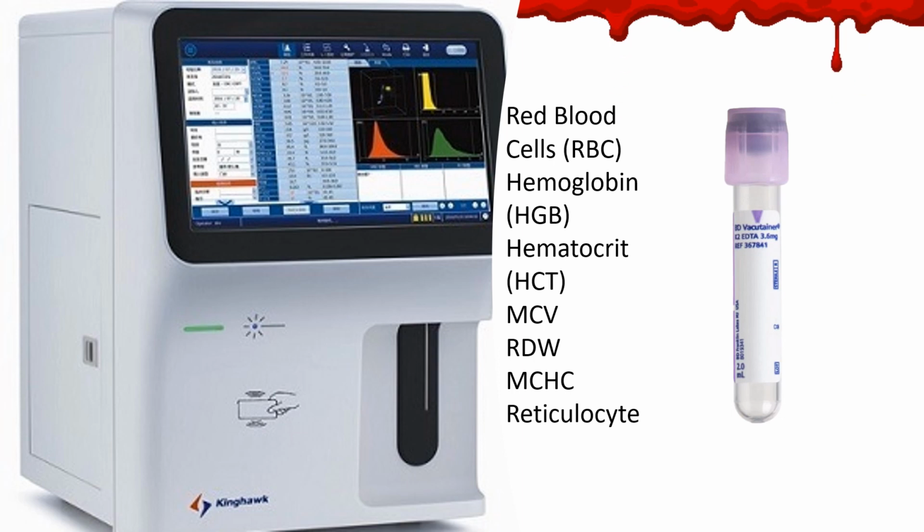So, una persona que agarró el tubo y lo agitó vigorosamente. El bioanalista, el laboratorio, no está al lado del que está sacando la sangre. Por lo tanto, él no sabe si él sacó la sangre con protocolos o no. El bioanalista no vio qué aguja tú usaste, ni cuántas veces el que sacó la sangre invirtió el tubo. Él no lo ve. Por eso, los errores preanalíticos son un problema para aquel que no lleva los protocolos en sí.